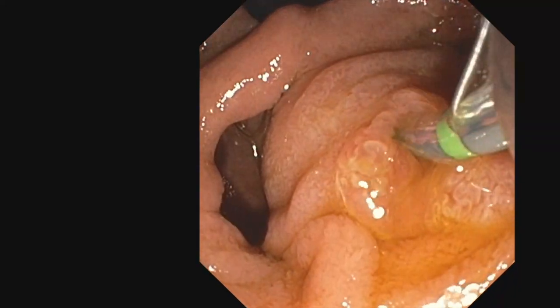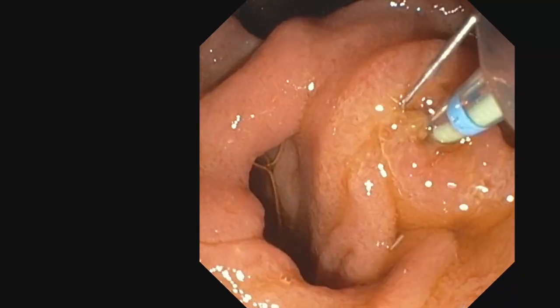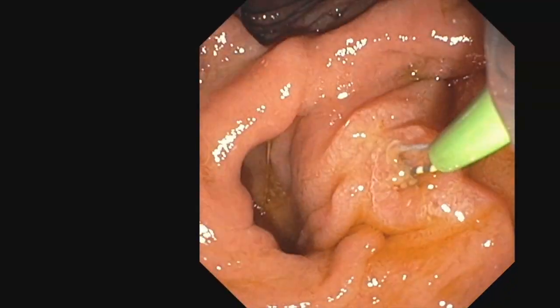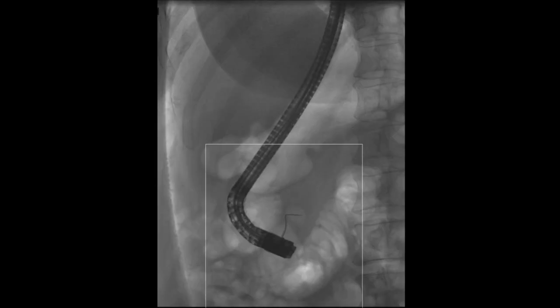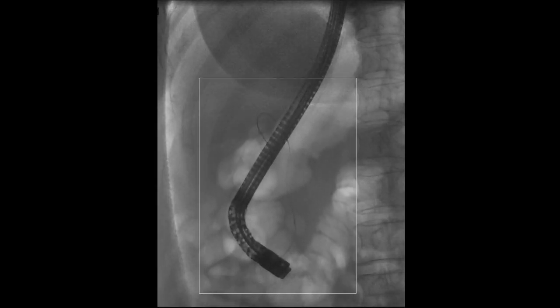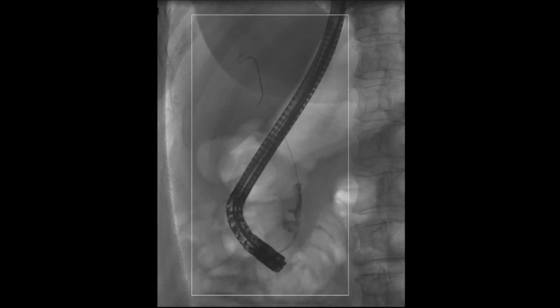A 60-year-old patient presented with large bile duct stones at MRCP. A large periampullary diverticulum was seen at ERCP, and the bile duct was selectively cannulated using a wire-guided sphincterotome. Cholangiogram revealed three large bile duct stones and a few smaller bile duct stones.